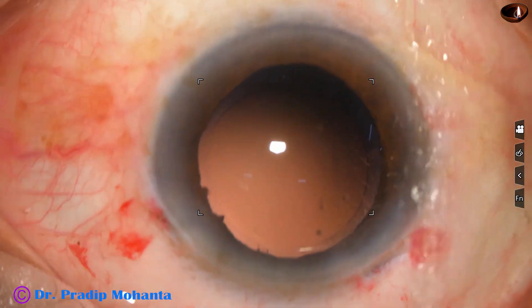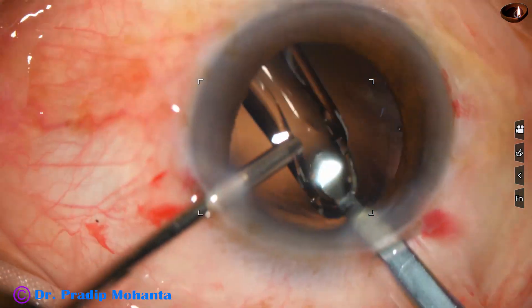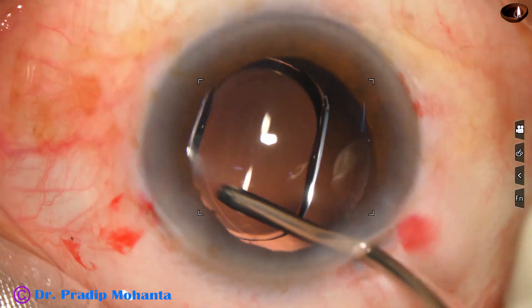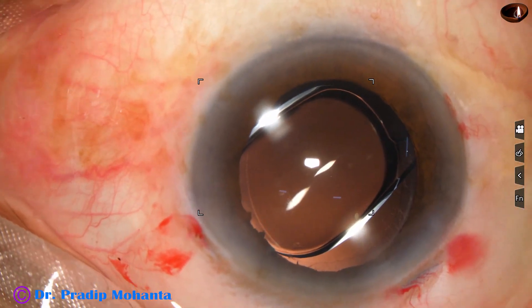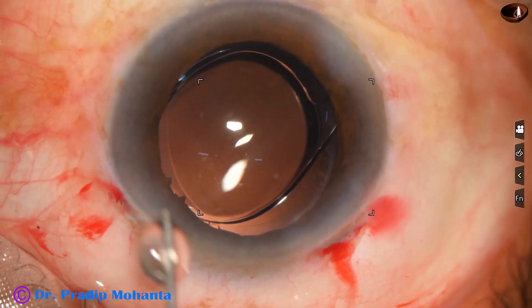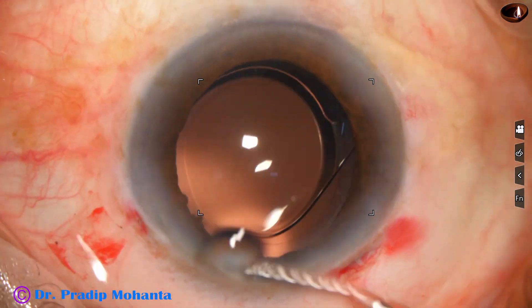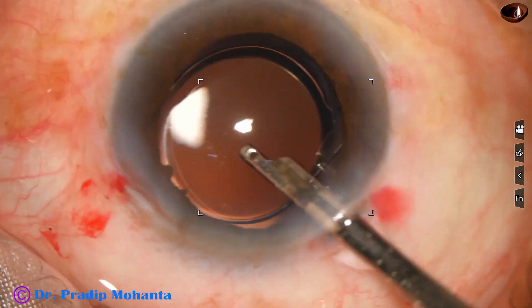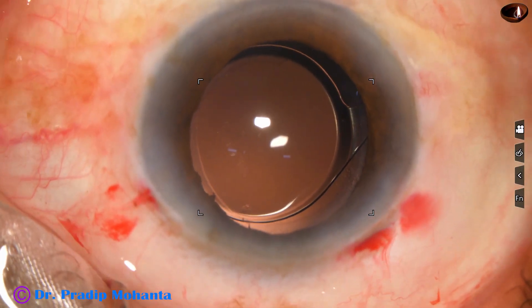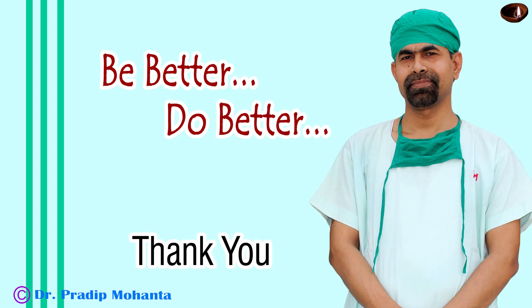We have managed the nucleus and now we are going to finish the case. The surgery is now at two times normal speed. After cortical clean-up, the intraocular lens has been implanted — this is a hydrophobic monofocal intraocular lens implanted in the capsular bag. The side ports are closed by corneal stromal hydration, followed by a final lavage of the anterior chamber to remove any viscoelastic that sticks to the corneal endothelium. The anterior chamber is nicely formed and a few drops of moxifloxacin are applied over the ocular surface.